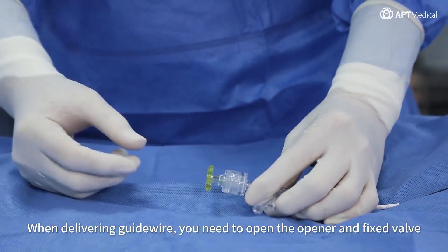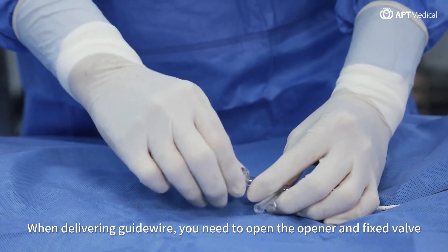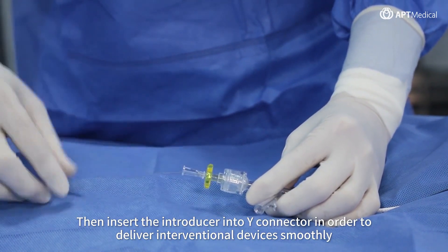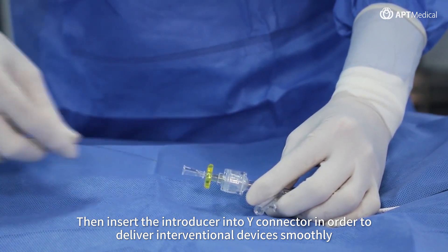When delivering a guide wire, you need to open the opener and fixed valve. Then insert the introducer into the Y connector in order to deliver interventional devices smoothly.